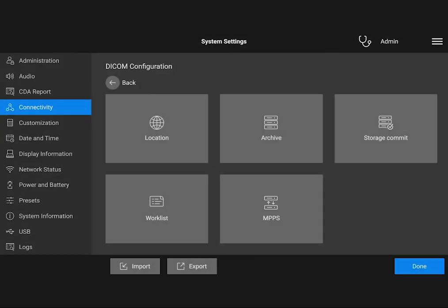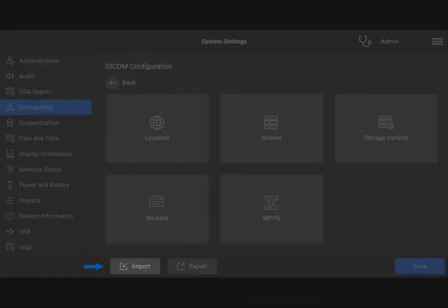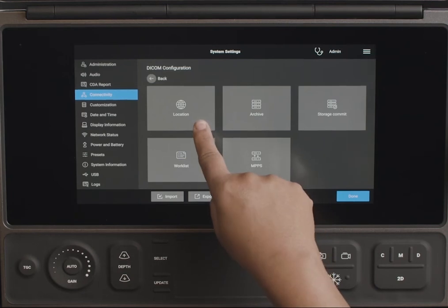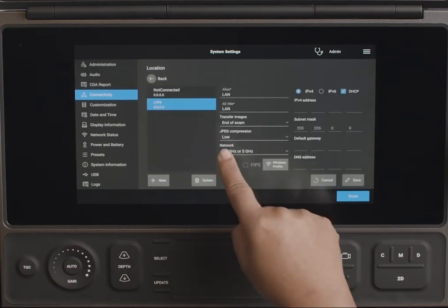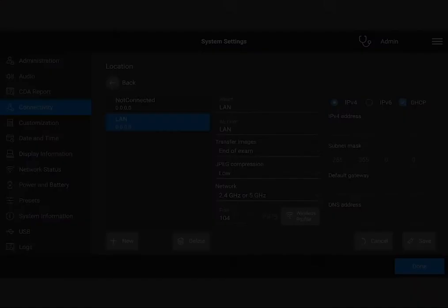If you have any questions, talk to your DICOM or IT administrator. You also have the option of importing a DICOM setup from a USB device. When you configure your system's location, you can also select wireless connectivity options.